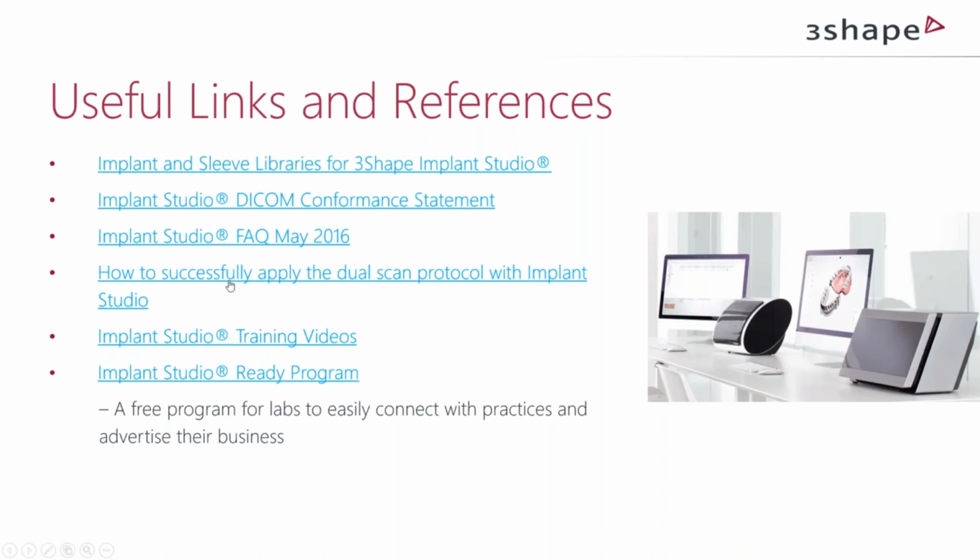You may have already heard about Implant Studio 15 and 16, where we now work with edentulous cases. In that workflow, we follow the dual scan protocol. On how to apply this protocol successfully in Implant Studio, we have an article here, a document. And here is the link to some training videos on how to use this software.